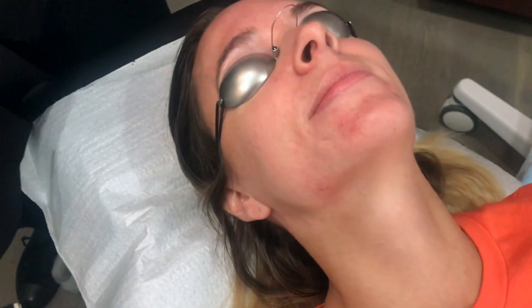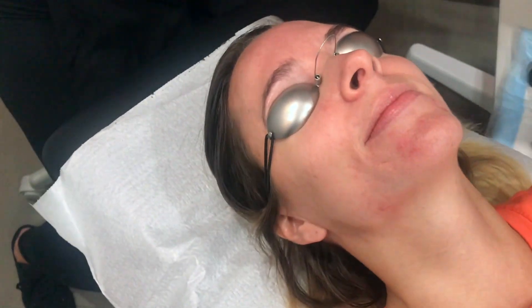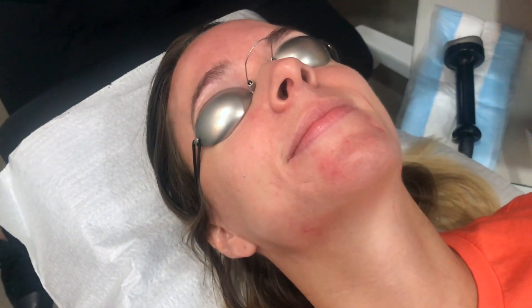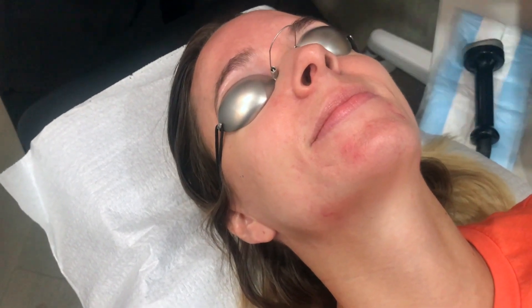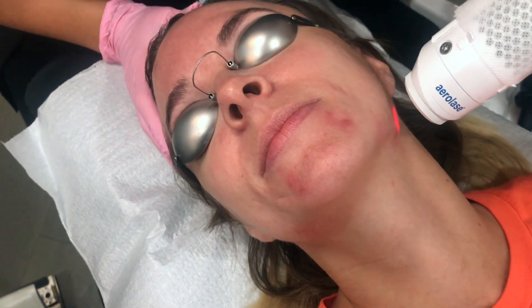Now we're going to use the AirLase, which is a 1064 650 microsecond laser. This laser goes a little deeper than the 532 — the longer the wavelength, the deeper things go. And we kind of just treat the entire face with this.